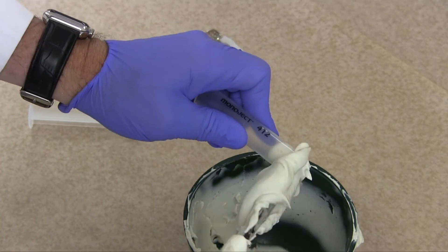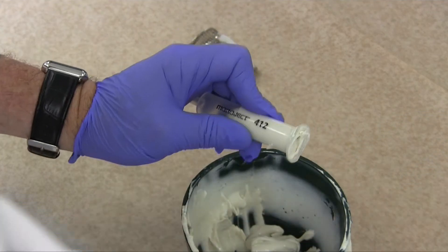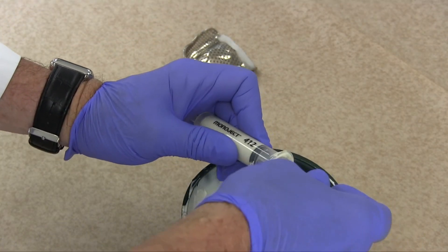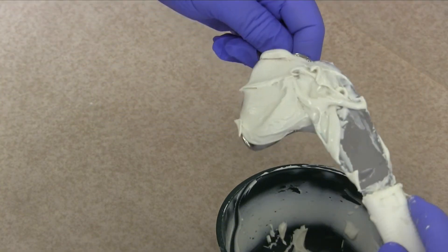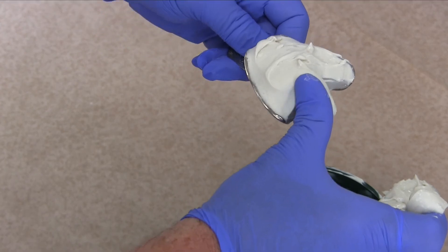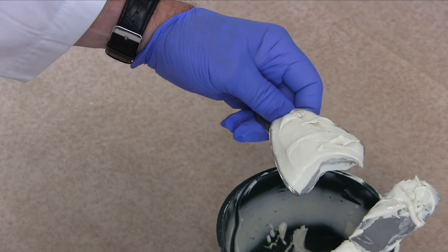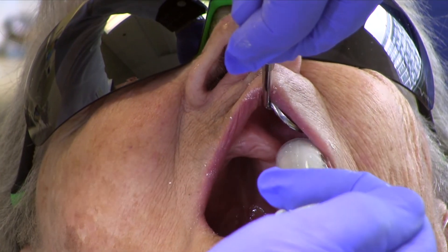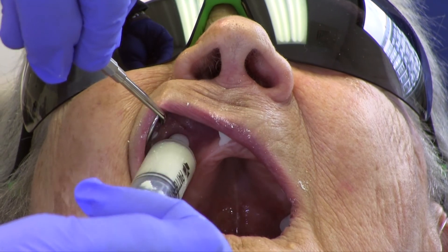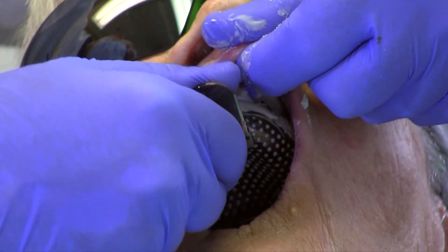Load the syringe from the back end until it is at least three-quarters full. Wipe off any excess, insert the plunger, and give the syringe to the operator. The assistant will load the tray while the operator is syringing alginate into the vestibules. Make sure there is no excess at the posterior border of the tray by evening the alginate with the wax placed previously. In the maxilla, begin filling the vestibule by syringing buccal to the hamular notch and then moving quickly toward the labial frenum. Then repeat on the opposite side and seat the tray.